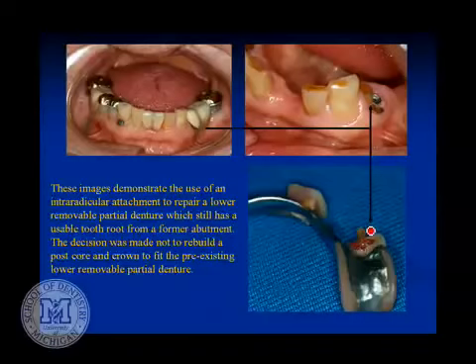and the top end of it you pick up with self-curing acrylic in the denture, and we added a denture tooth onto the partial. So where the abutment tooth was, we cut part of the framework away with self-curing acrylic. We attached a denture tooth to the partial denture, and then on the underside of the denture tooth, we hollowed it out, and with self-curing acrylic, picked up this little pop bead that now goes down in this little recess. They're easy to do because you can do them in one appointment.